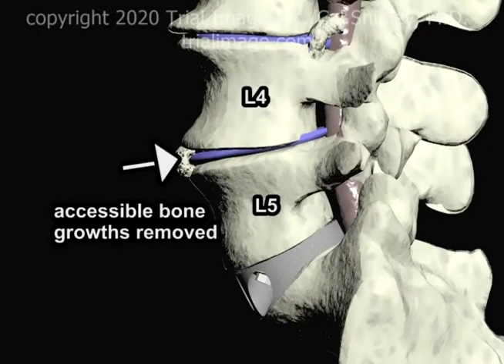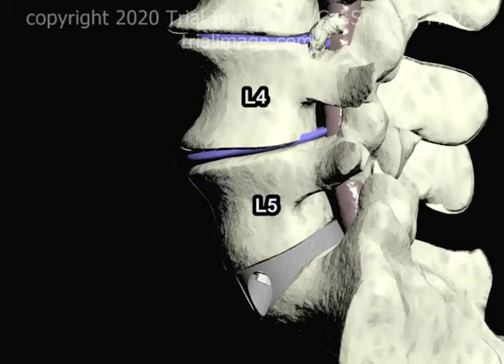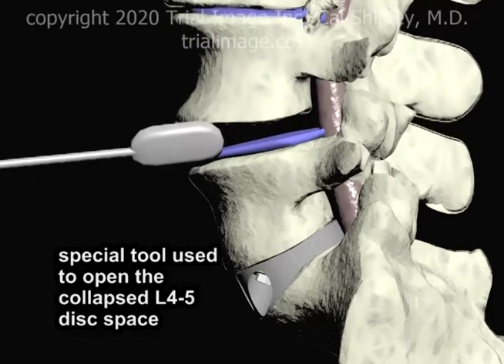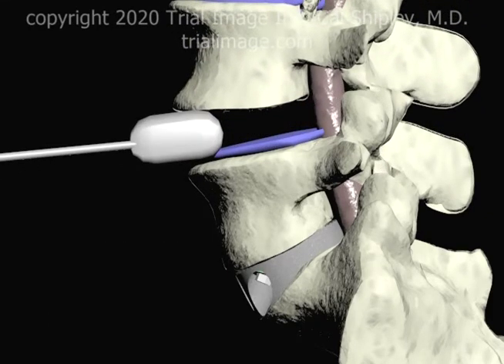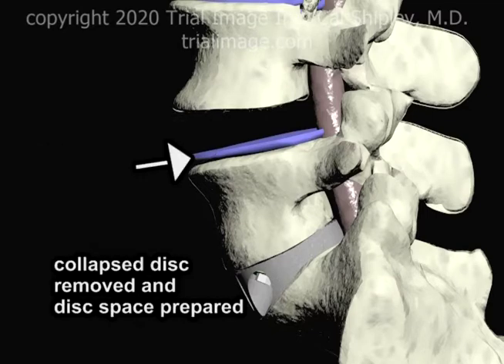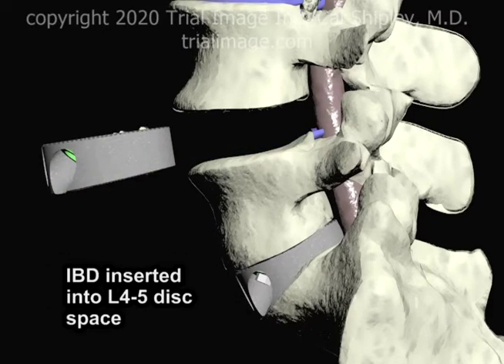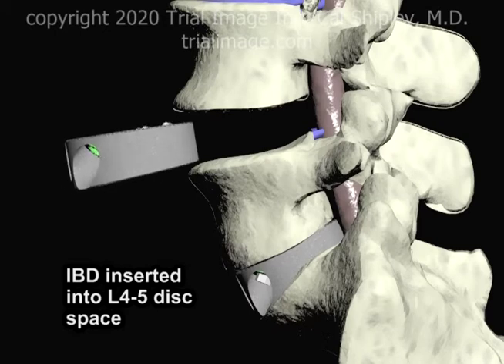Moving up to the L4-5 disc space level, accessible bone growths and spurs are removed, and then a special tool is used to open up the collapsed disc space. The disc remnant is removed, the disc space is prepared, and then an interbody device packed with graft is inserted into the disc space and anchored with screws.